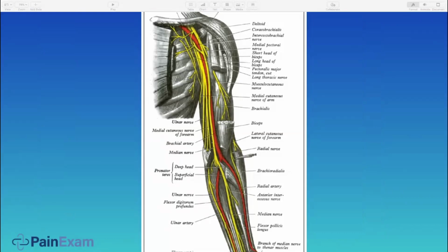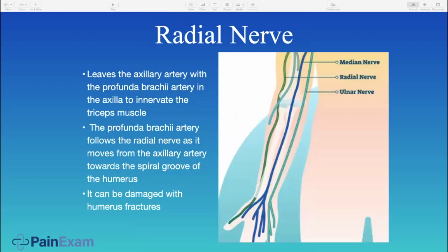Once again, just to go over the anatomy, we've covered the ultrasound, infraclavicular; supraclavicular is not really shown here. You can see here how the axillary brachial plexus will come to the mid-humerus level. It can be blocked over here. I do not get into it so much in this course. In addition, we have the lateral pectoral nerves. You have other nerves which are blocked with other types of fascial plane blocks, and I'll go over these in future courses. I'm not getting into everything such as the PECS, the PENG. I'm not doing that in this course.